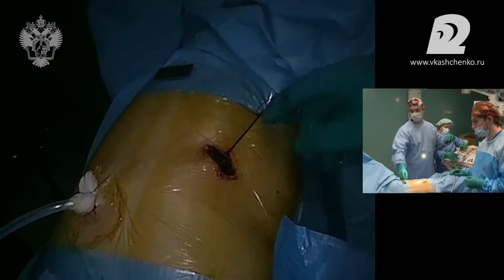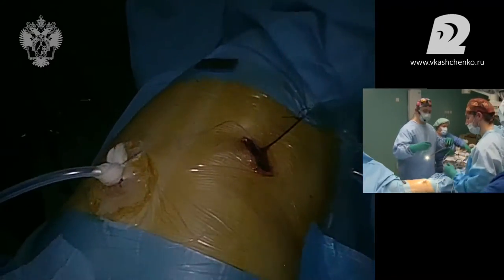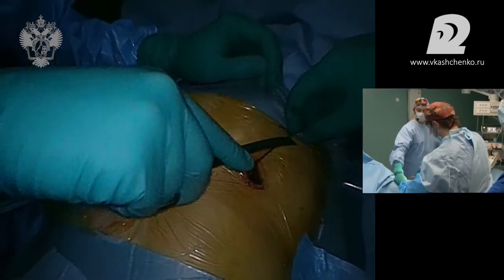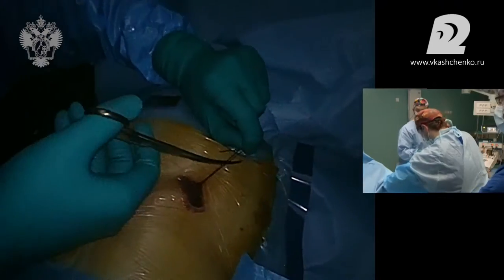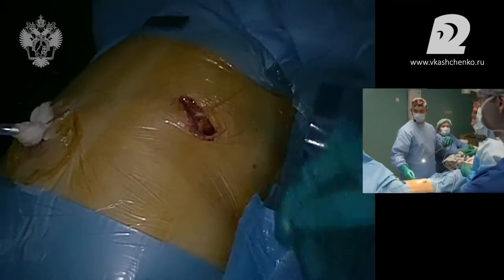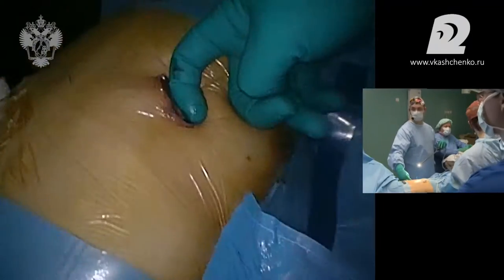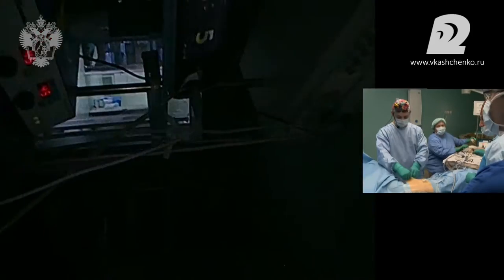This is the external picture via two ports. In fact, they performed the whole surgery, which usually requires a quite massive thoracotomy from the right. As far as I understood, paratracheal lymph nodes were removed, I remember. That means it's 2S lymphodissection, but not 2M, 2F, excuse me.